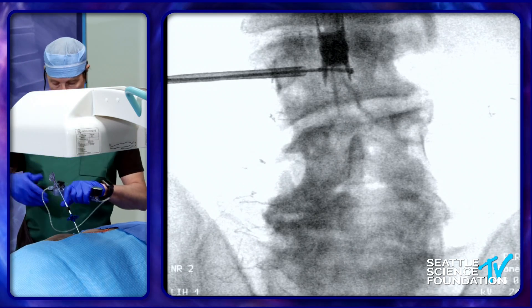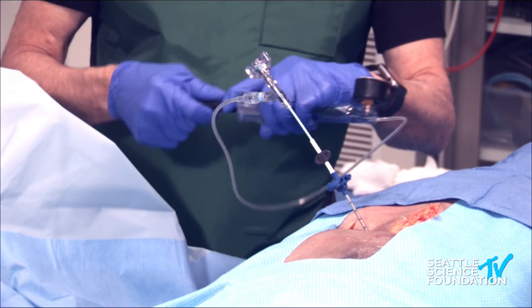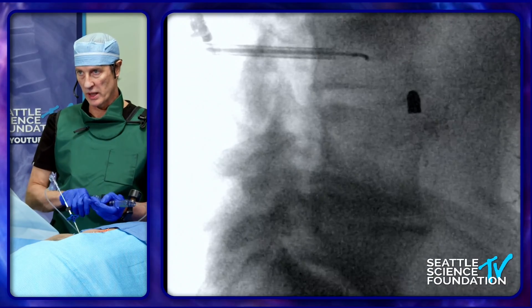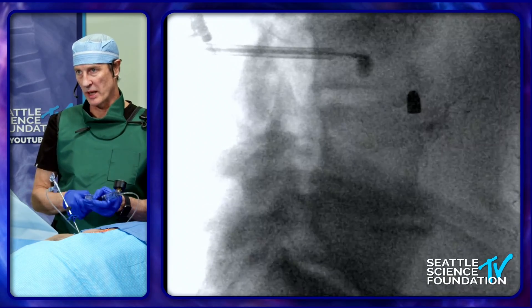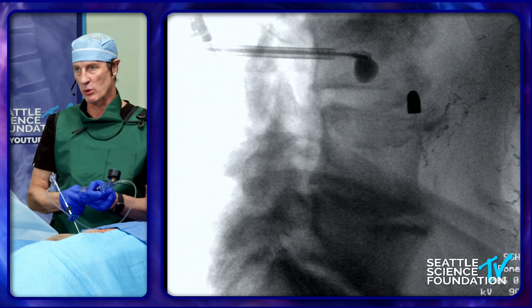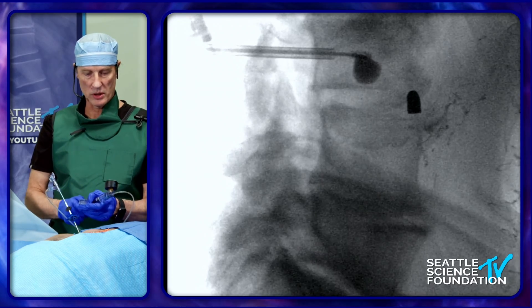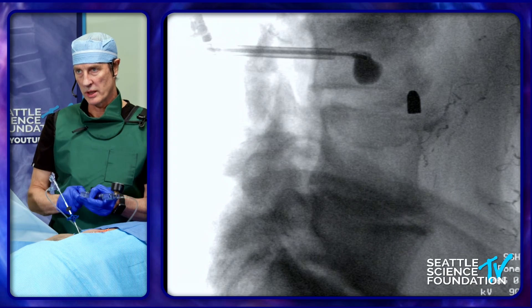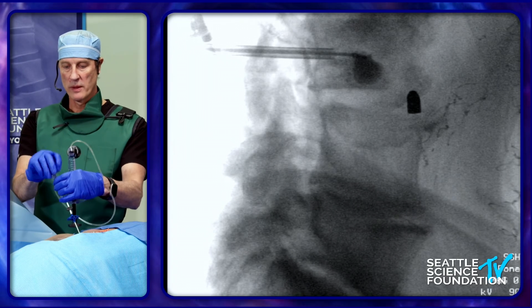We'll start inflation by looking lateral. I'm going to engage the high pressure Levine syringe, and we'll take a look on the lateral view. Hopefully we will see the balloon start to inflate. It's kind of being blocked a little bit by the sclerosis that's anterior and superior, but we're going to do this anyway. This is a balloon that's deployed more medial-lateral, and this is a very high pressure balloon — made by Merit, it's called the Arcadia balloon. I'm going to inflate it just a little bit more until it pops. Incredibly dense bone. Then we unscrew it and add cement.